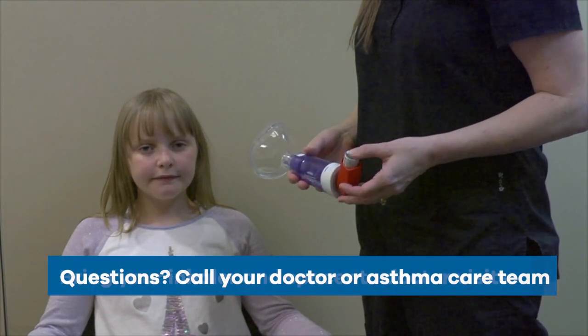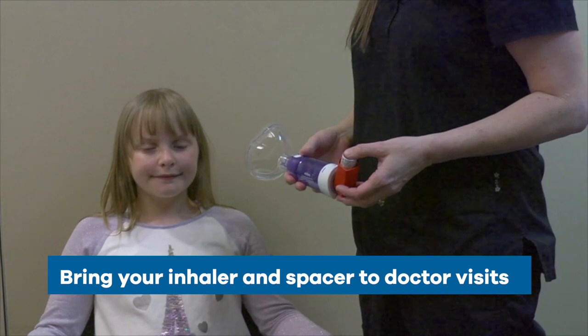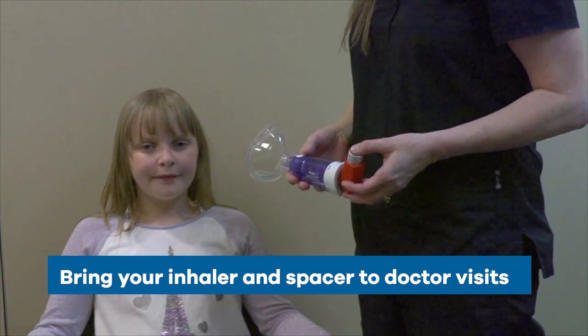Remember, if you have questions, call your doctor or asthma care team. Bring your inhaler and spacer to every visit for asthma so you can show us the technique you use.